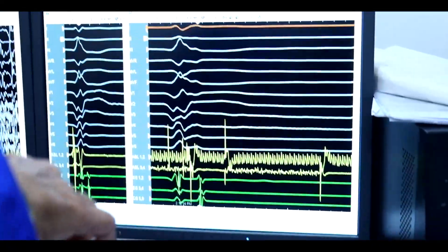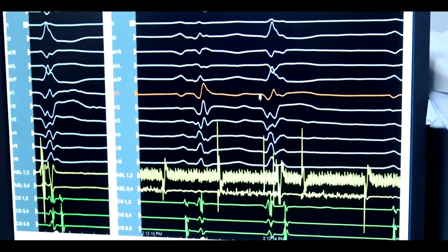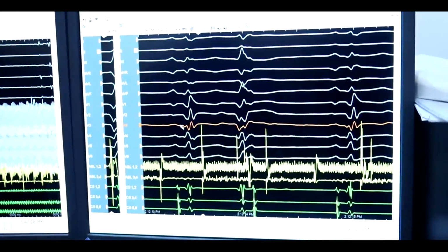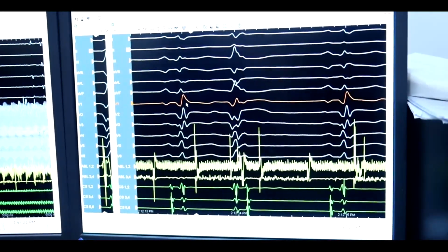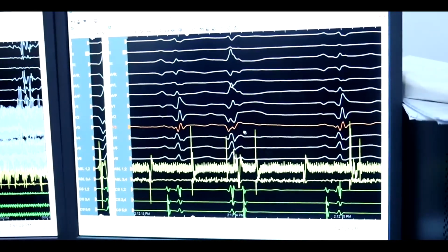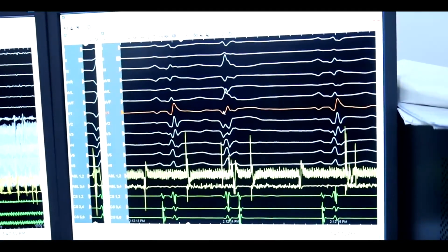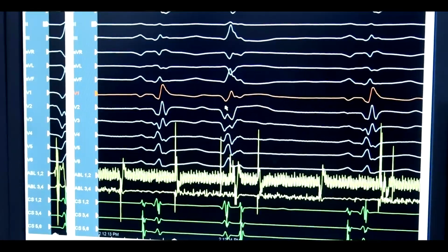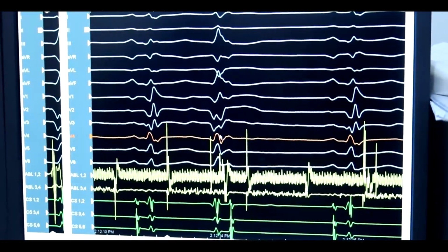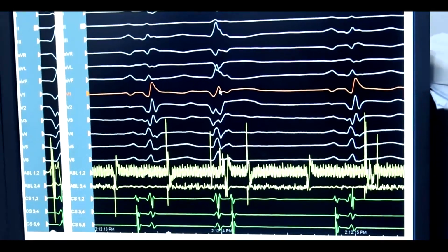This is the 12-lead ECG of the PVC at the beginning, when they prepared his ECG. He has sinus rhythm with the right bundle branch block already. And these are the clinical PVCs, which came in a bigeminal rhythm. As we can see, it is a right bundle pattern, but with a W-shaped QS pattern in V2, and a transition in V4. But it's a right bundle PVC.